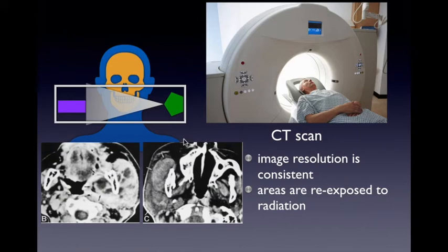You would see a three-dimensional slice of a patient that can be compounded, and that would develop into a three-dimensional picture of your patient. This produces a very consistent appearance. But as we remember, X-rays are not linear. X-rays, in terms of their physics, will produce a cone of radiation.